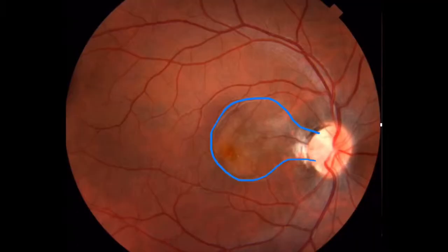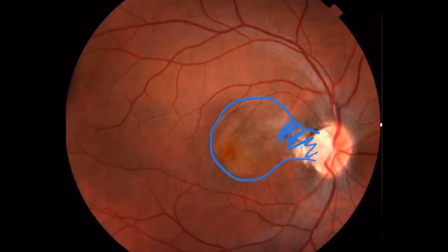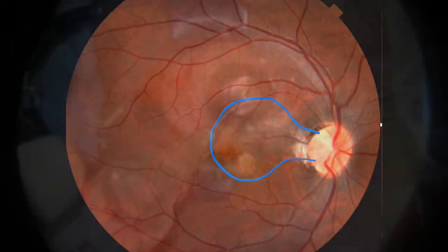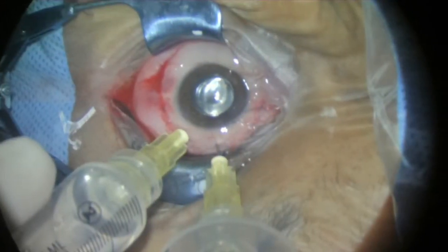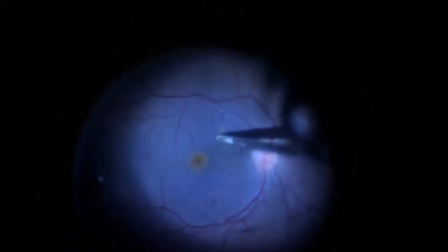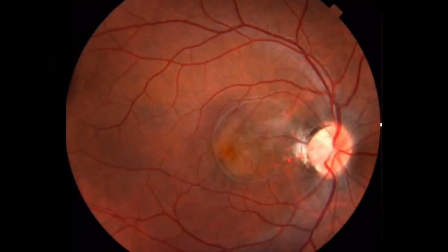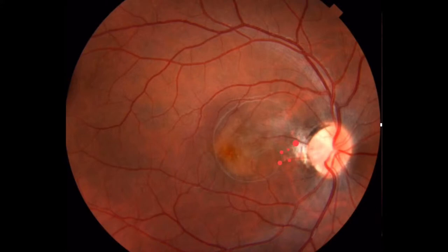Peripapillary vitreous traction is the trigger in these cases, causing separation and the retinal detachment. There are several surgical adjuvant techniques including gas tamponade, ILM peel, and temporal optic disc endo-laser.